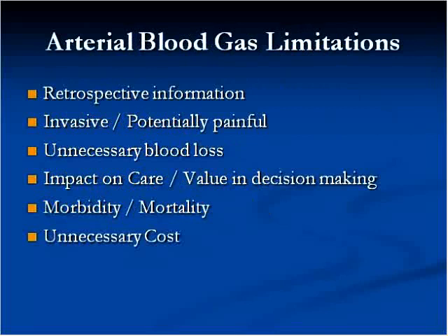Do blood gases have limitations? Well, absolutely. Number one, we are getting retrospective information. I heard one individual say a blood gas is like a Polaroid from the past, whereas pulse oximetry is streaming video. And there is some truth to that.